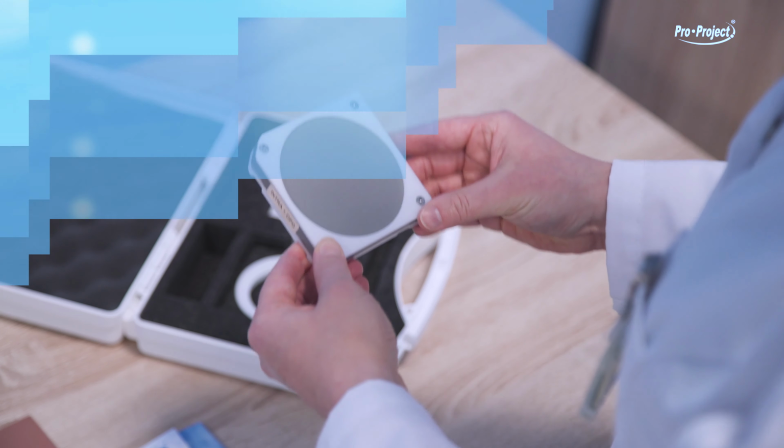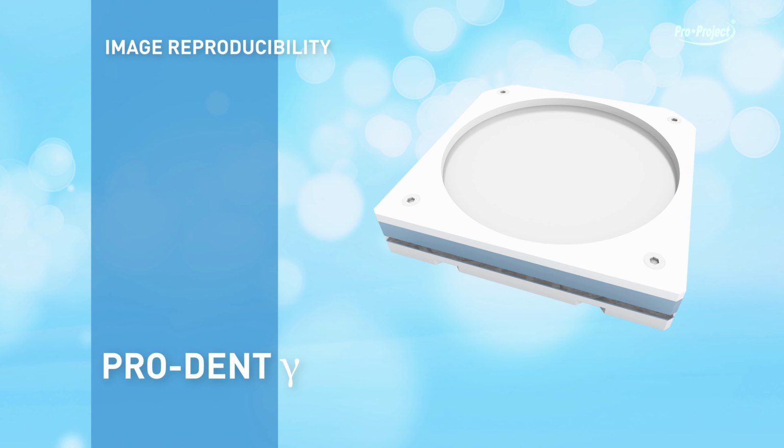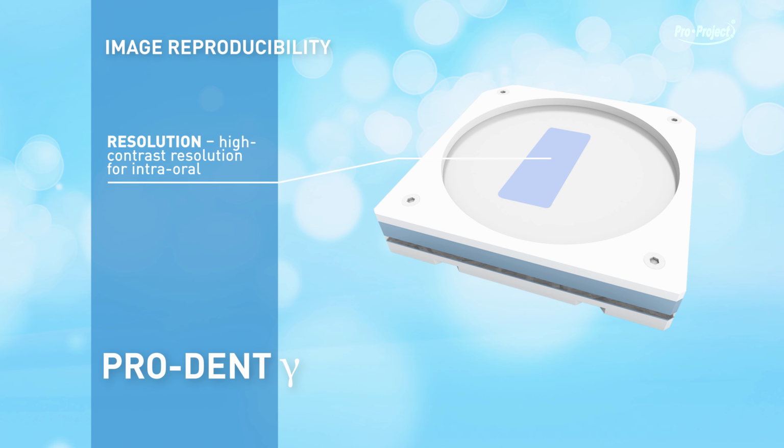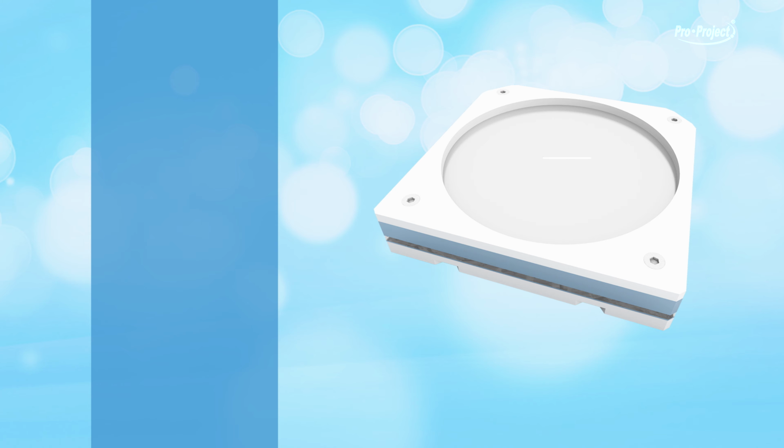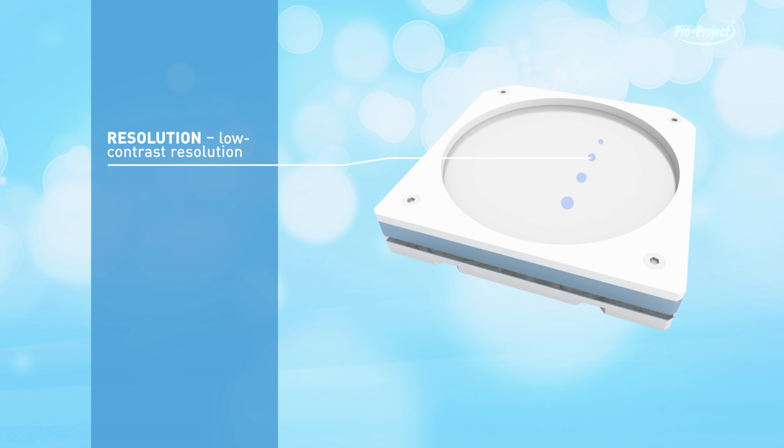Pro-Dent Gamma. Image reproducibility. Resolution, high contrast resolution for intra-oral. Resolution, high contrast resolution for panoramic and cephalometric. Resolution, low contrast resolution.